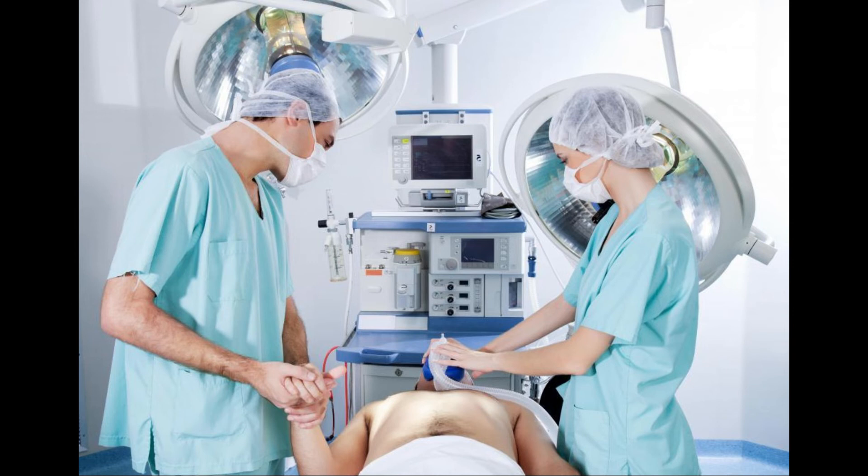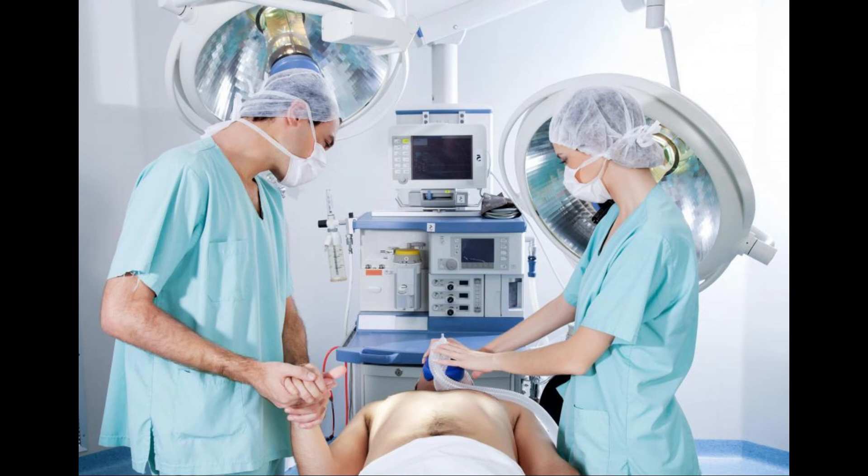Alternatively, an endoscope may be used to see the inside of the patient's gastrointestinal tract. Though it would seem that this method would yield a greater success rate, both methods result in correct placement about 90% of the time.